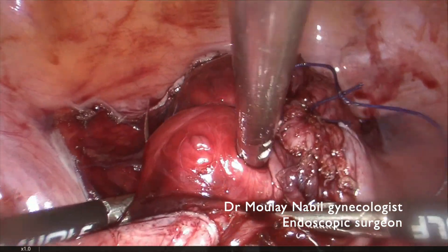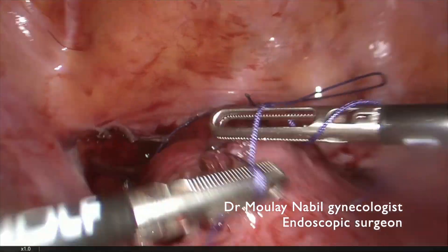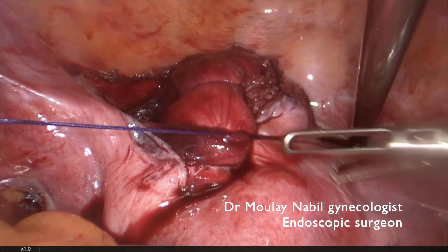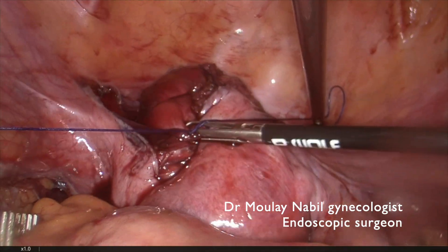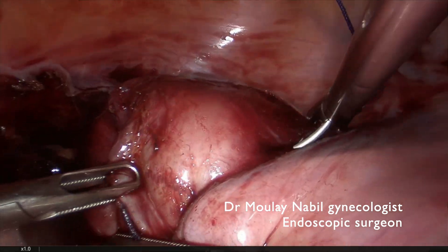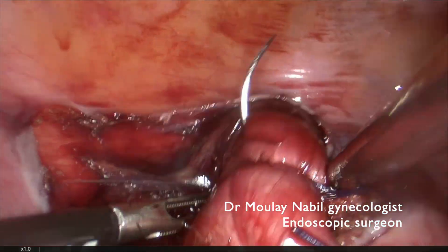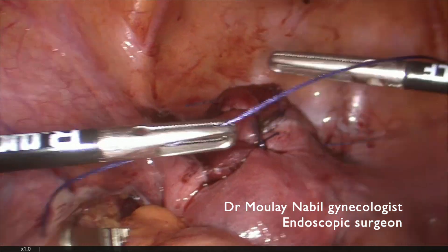The second knot is placed just 1 cm above the previous one — same technique: 2 cm outside the uterine scar, double flat knot, intracorporeal knotting technique. We tie the knot, invaginate the tissue, and the job is done. Now the third knot is placed just below the first one, same technique. It's mandatory to have a well-trained assistant for laparoscopic myomectomy to save time, as there are numerous sutures during this procedure.